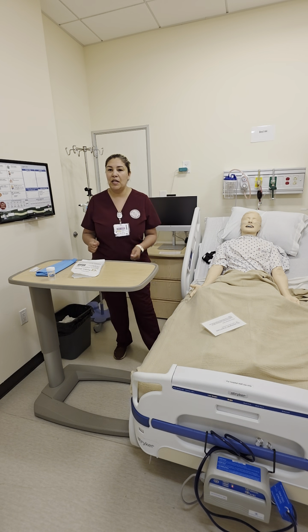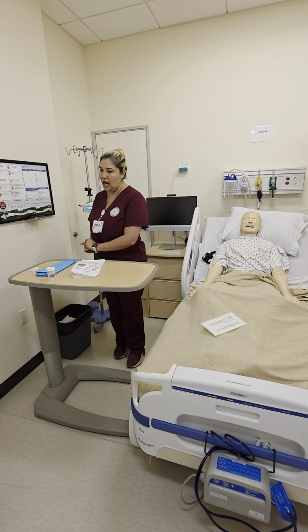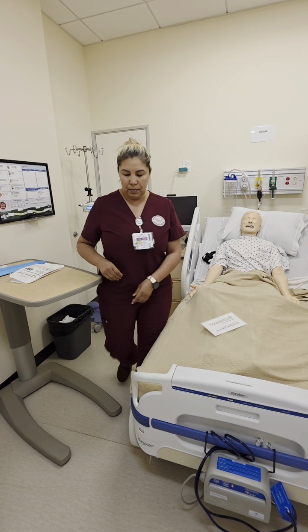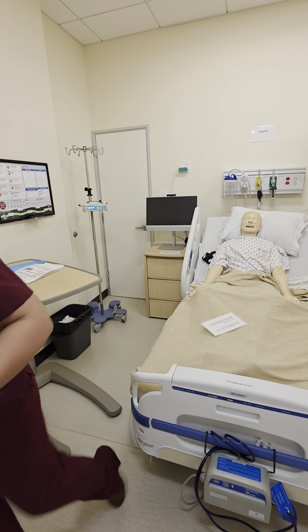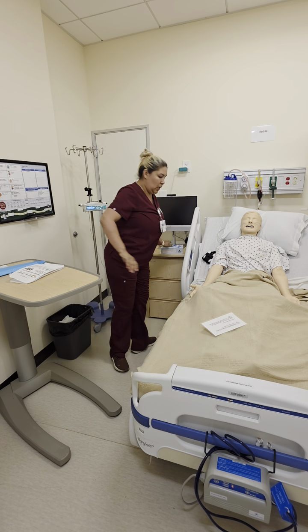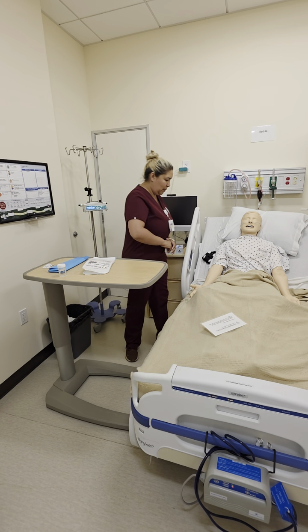Okay, I'm going to come into my patient's room. I have already provided privacy. I'm going to perform hand hygiene, and I'm going to walk up for a second and grab my gloves. I'm so sorry. I'm going to perform hand hygiene, and I'm going to come into my patient's room.